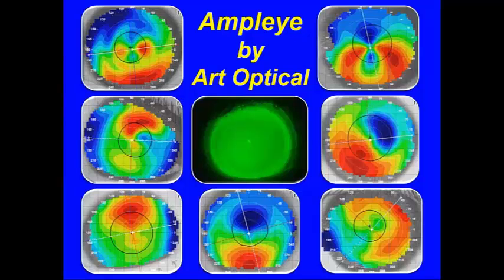I would still start off with the 4000, but I'd take into account the central K rating and the size of the cornea. We do know that larger corneas are going to have that greater sagittal depth, and therefore if you have that combination of the steep central K rating and a larger than normal visible iris diameter, those are the 2 ingredients that will tell you that you really need to move to a greater sagittal depth lens. So a good observation, whoever made it, but again, it's that combination of elements, the steep central K readings and the larger than normal visible iris diameter.